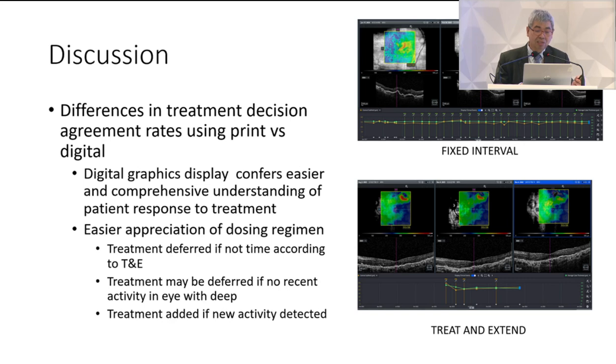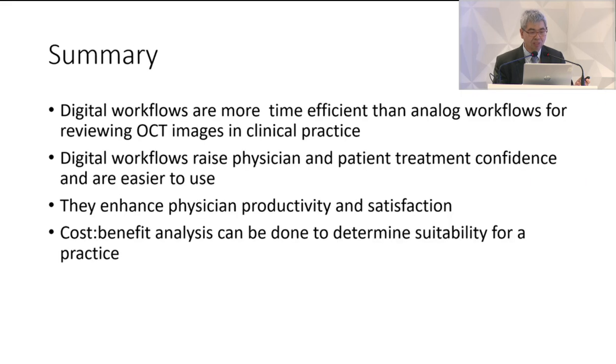Differences in treatment decisions might be related to the ability of the doctor to figure out the dosing regimen based on print images. But on the digital images, you can clearly see here on the upper screen, this is a fixed interval treatment dose. And on the bottom screen, a treat and extend treatment dose was being used. And this is very easy to see on the digital workflow, but not too easy on print workflows.